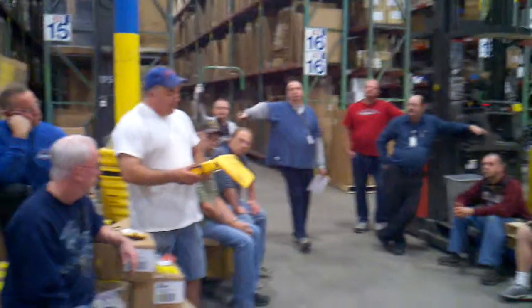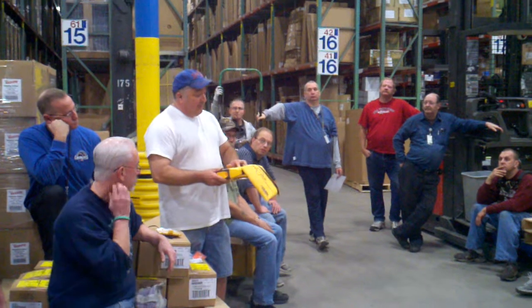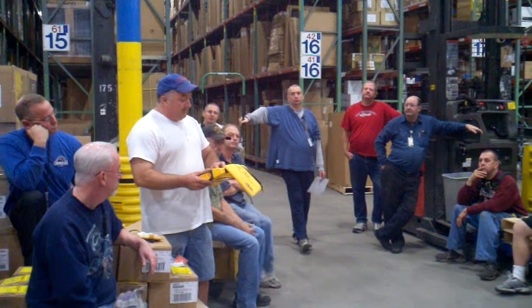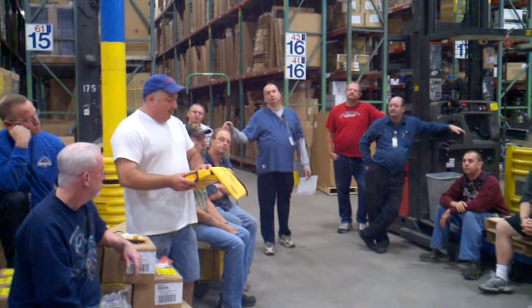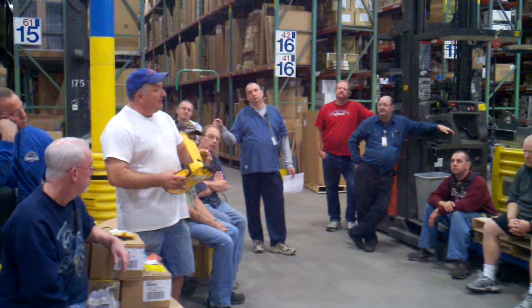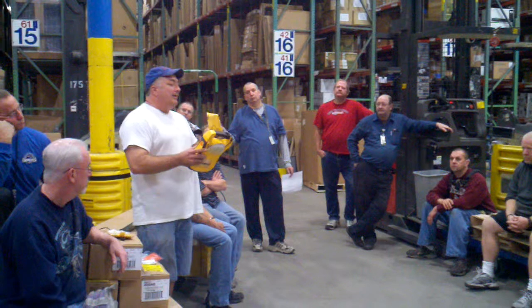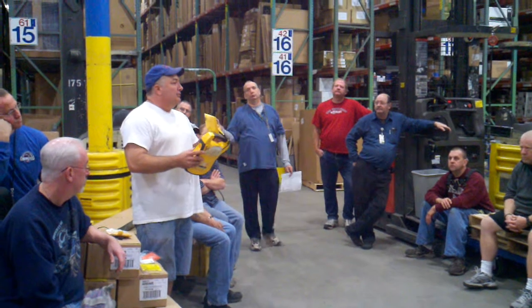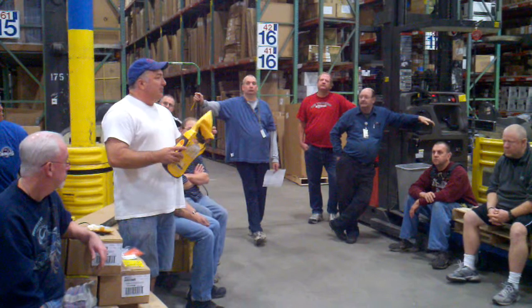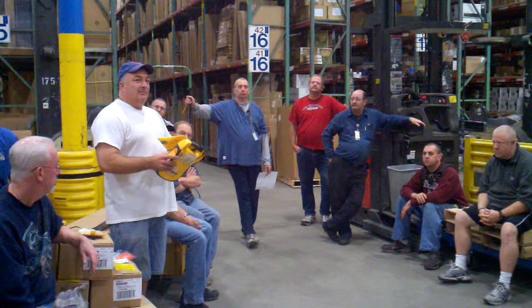It's going to tell you if the pads aren't on right. It'll verbally tell you that. I believe this one will verbally tell you. If not, it's lit up here. The do not touch patient warning will either be said or this light will go on. It also tells you when it's analyzed, and then you have the shock button. It'll start out at 100 joules and work up to 300. I don't know how many times this will let you shock, but by the time somebody gets there, you won't have to worry about doing too many. I think that's about it.